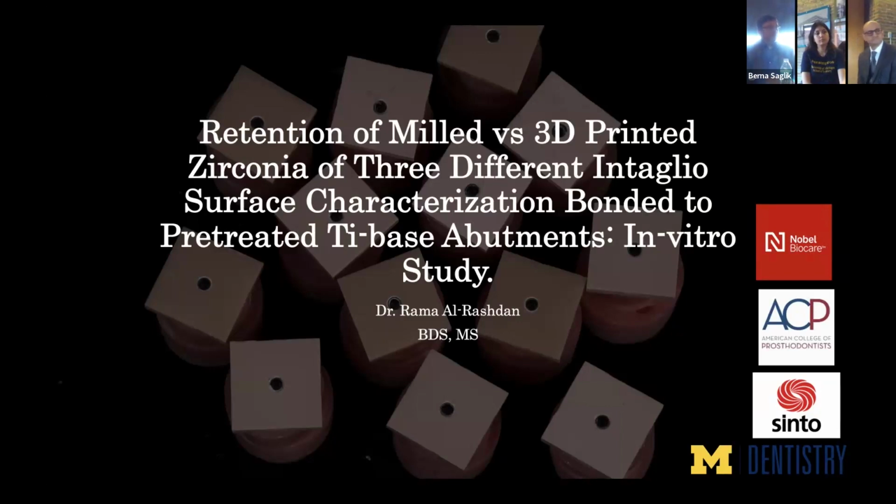So I think in a dental lab type setting, if you are going to work in a full dental lab to build these restorations and customize them for patients, that dental lab setting would be the ideal setting for a full zirconia or full silicon nitride dental replacement implant to be manufactured. It would probably be in a lab, not in an office or chairside type setting. I think so too, at least for now. Yes, just because of that post process, that debinding, sintering, there's a technical skill set needed.